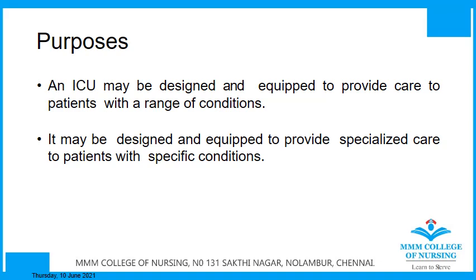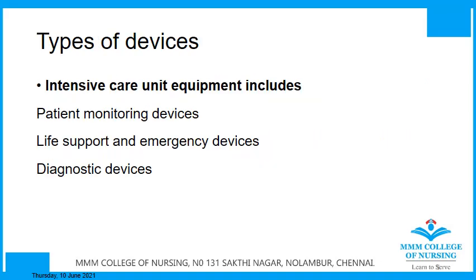Let's see what are the purposes. So these ICU equipments are mainly designed and equipped to provide specialized care to patients with specific conditions. Types of devices. Further, the types of devices are classified into three. They are patient monitoring devices, life support and emergency devices, and diagnostic devices.